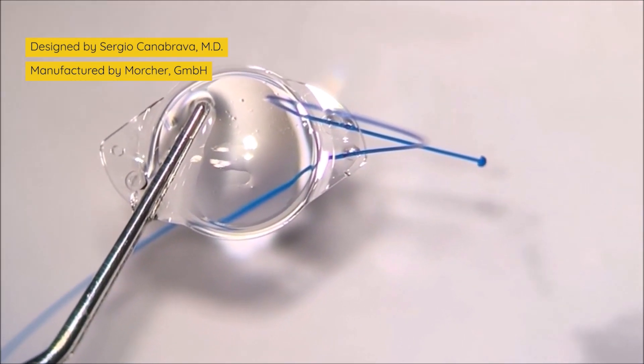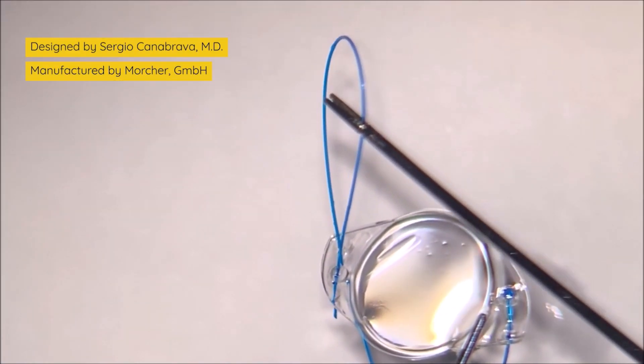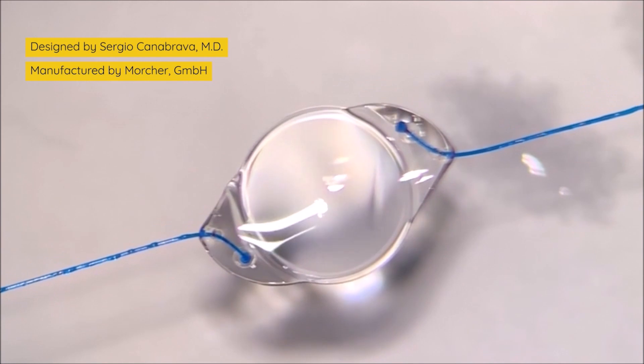Then you repeat the procedure on the other side, and you can see that we have an adjustable haptic that can be easily inserted inside the eye. The shoelace-like arrangement is the big deal about this new IOL — it's what makes the IOL stable.